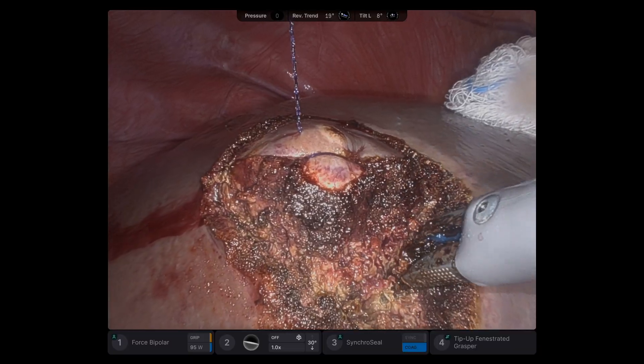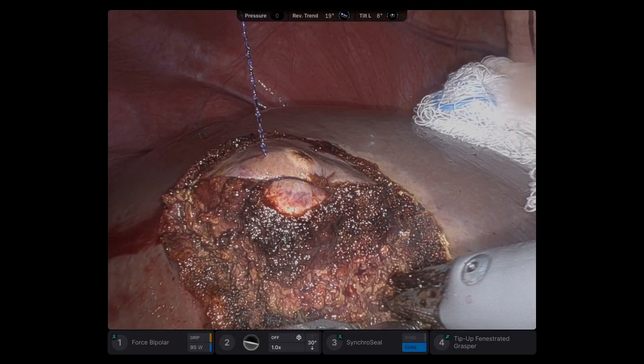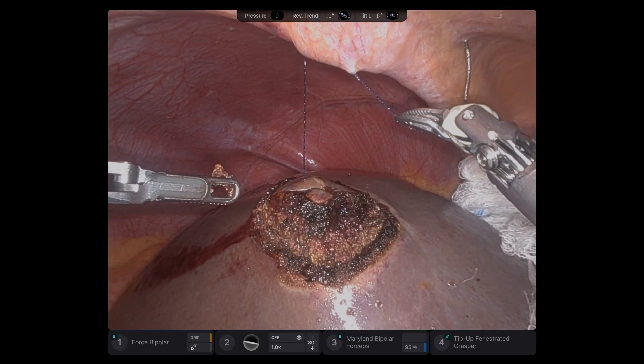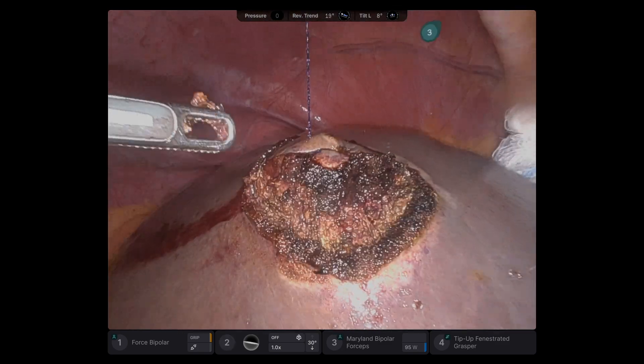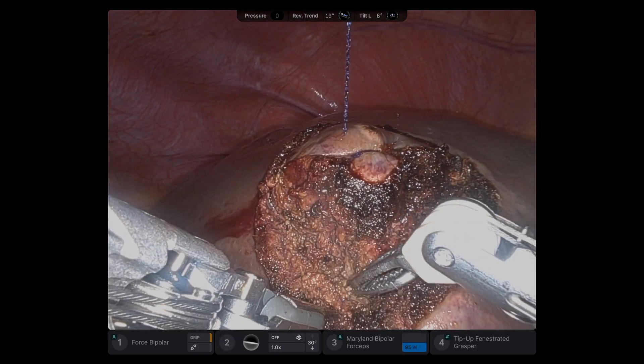If this was a bigger tumor, I would be continuously checking with ultrasound, but here I knew I was in the clear. So I'm going all around — small bites. As I go, I lift and pull on that V-Log to give me retraction.